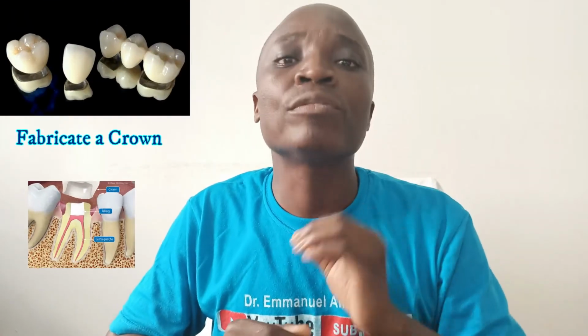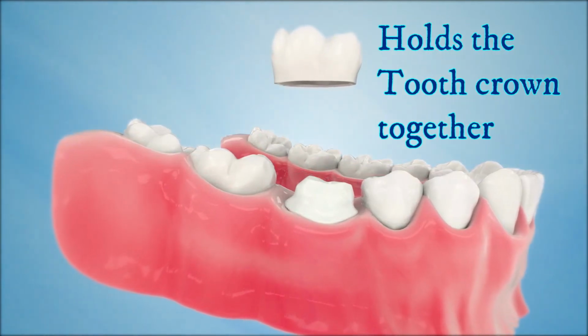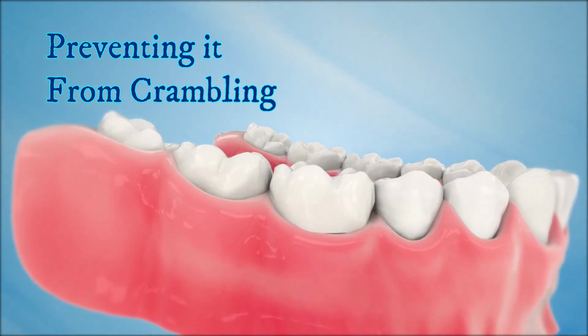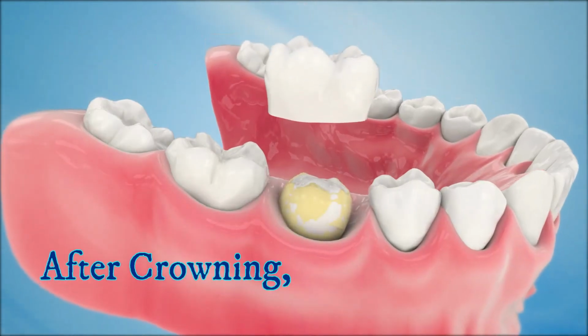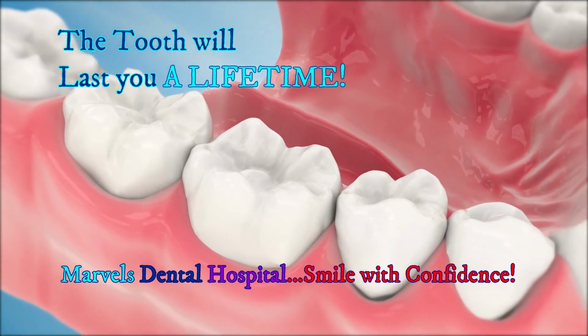So if we leave it at this point, it means that with time, this tooth can crumble under the stress of chewing. And that means that we have to fabricate a crown for it. This crown, which is fabricated in the lab, will ensure that the whole crown of the tooth is held together, therefore making it withstand all chewing stress. And this tooth will surely last you a lifetime. At this point, root canal is said to have been completed.